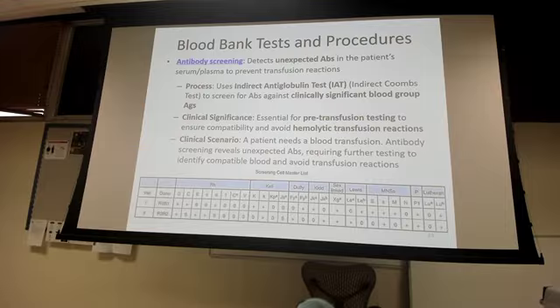We're washing cells, spinning them down, heating them up, looking at them, okay? And so here I think it's about 1, 2, 3, 4. There's about 7, but sometimes you can go up to about 20 times that we're doing this. So it can be very, very meticulous. So during the antibody screen, we're just identifying antibodies, okay?